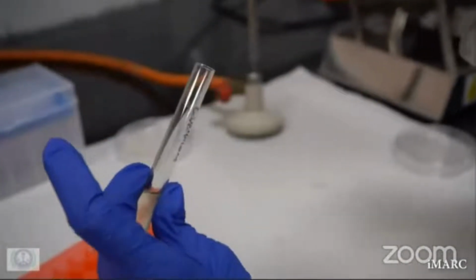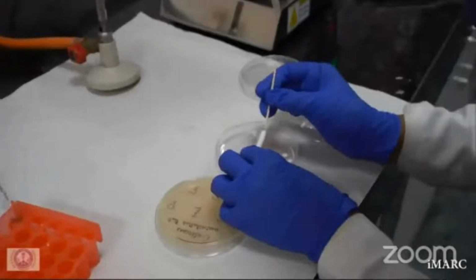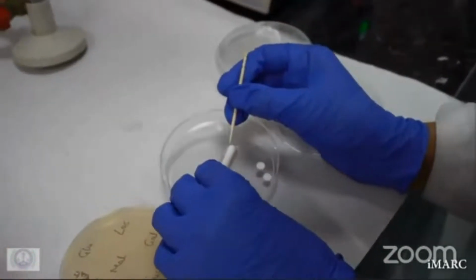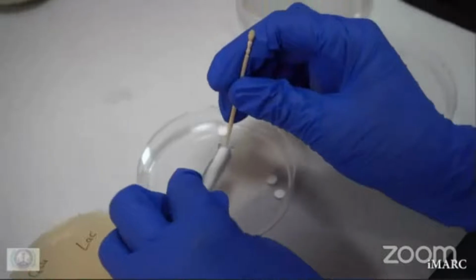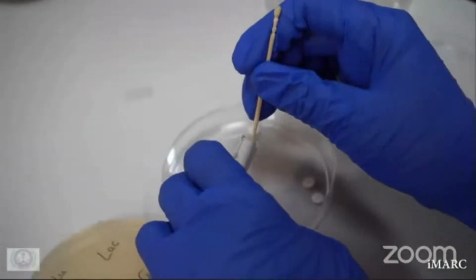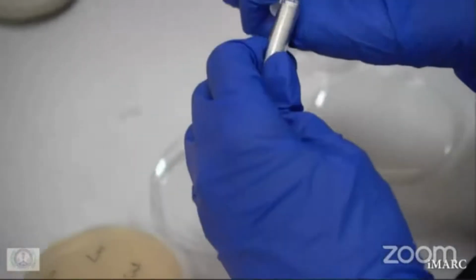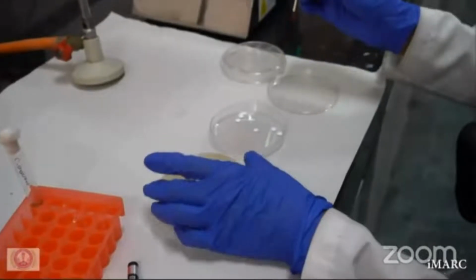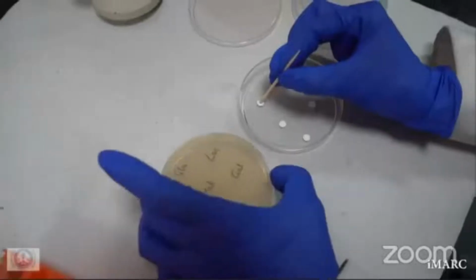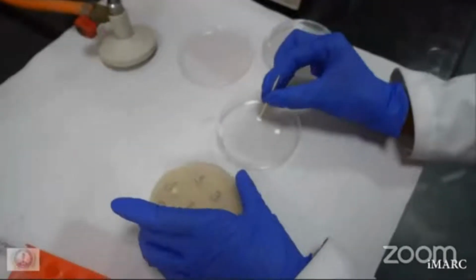The presence of growth around the disc is considered positive for that particular carbohydrate. Growth around the glucose disc is recorded first, which serves as a positive control and indicates the viability of the yeast. And here we may remember that 6 sugars are used for sugar fermentation and 12 sugars are used for sugar assimilation. So with this we come to the end of the flow chart for the identification of yeast.